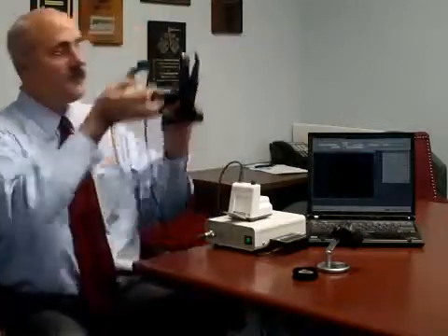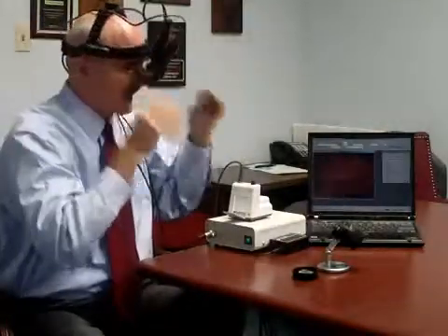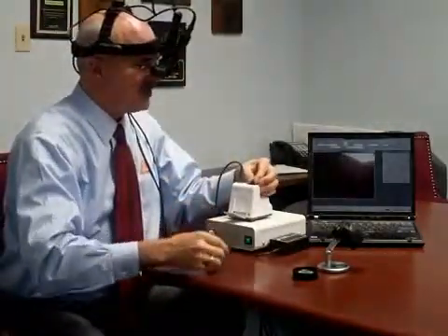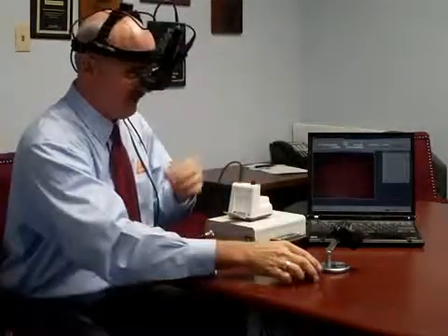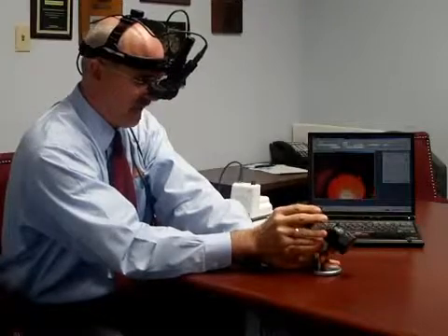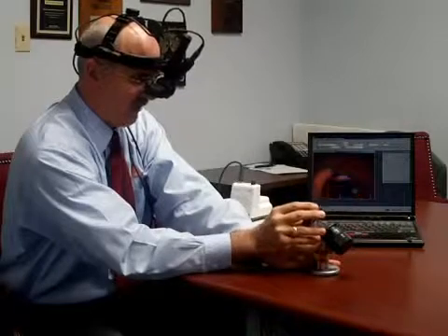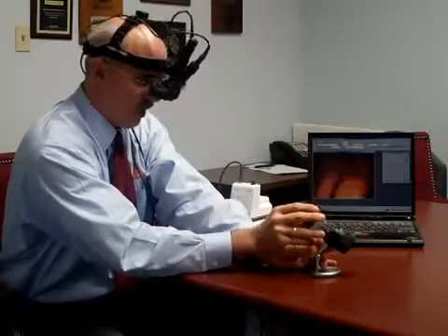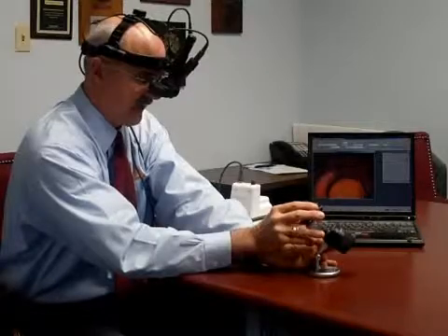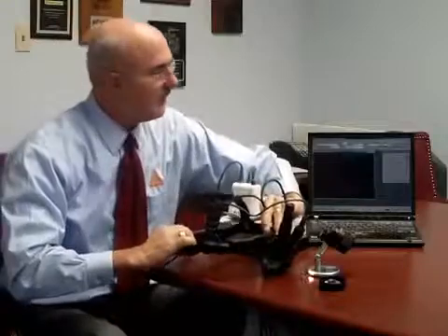Let me show you how it works. By putting the instrument on in a manner typical to any indirect and turning the light up to a modest level, you do the exam just as you would any indirect ophthalmoscopy exam, looking throughout the periphery, posterior pole, and all of the various landmarks that you're accustomed to seeing. The video images are displayed on the computer, or on a TV monitor connected to a VCR.